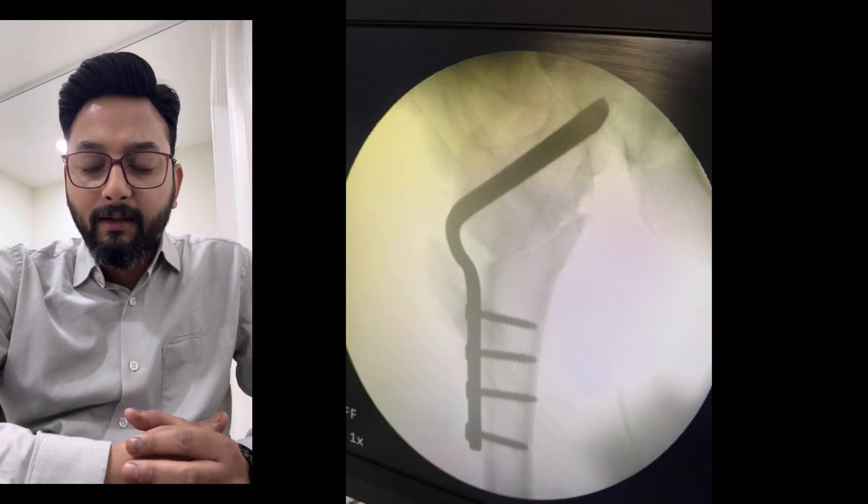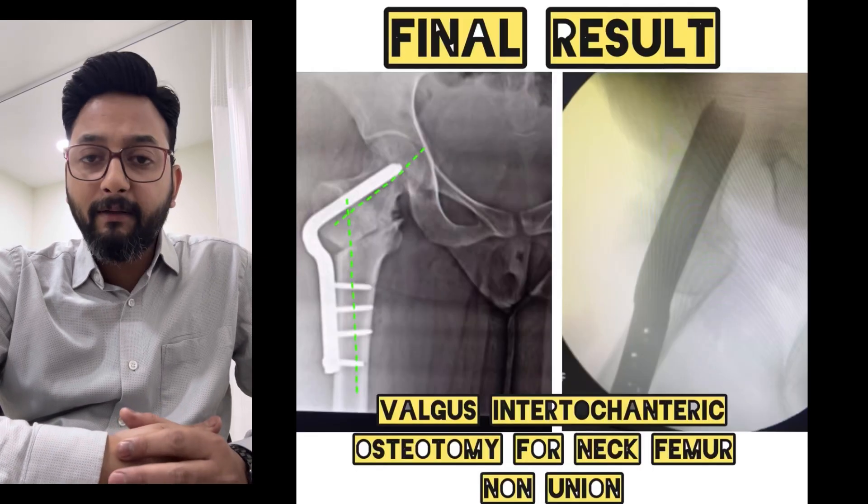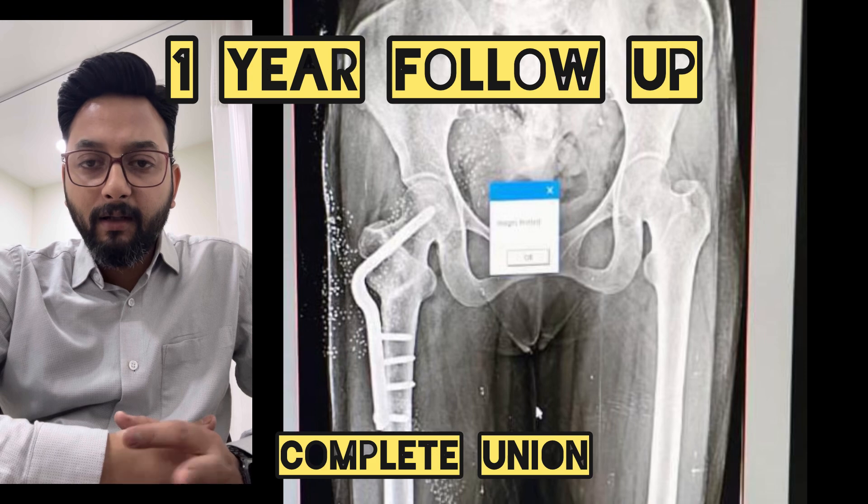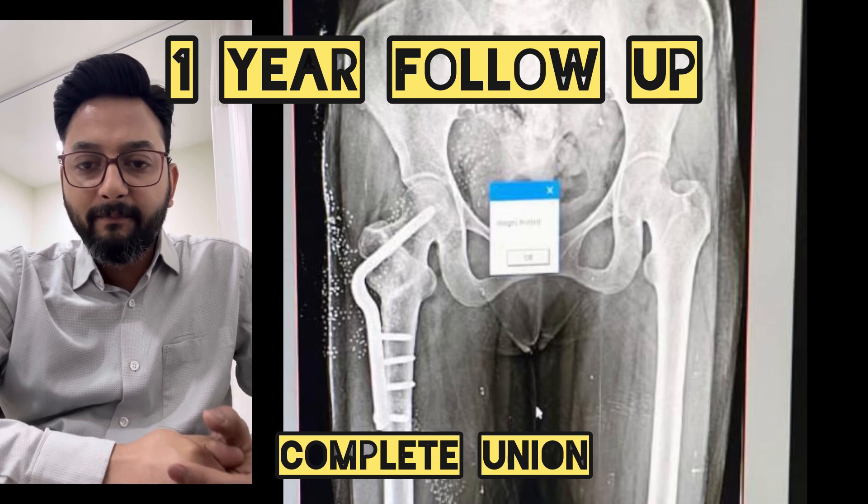The case was done and these are the post-operative x-rays — immediate post-op x-rays. And here is the follow-up at 1 year. The fracture is completely united. Thank you very much.